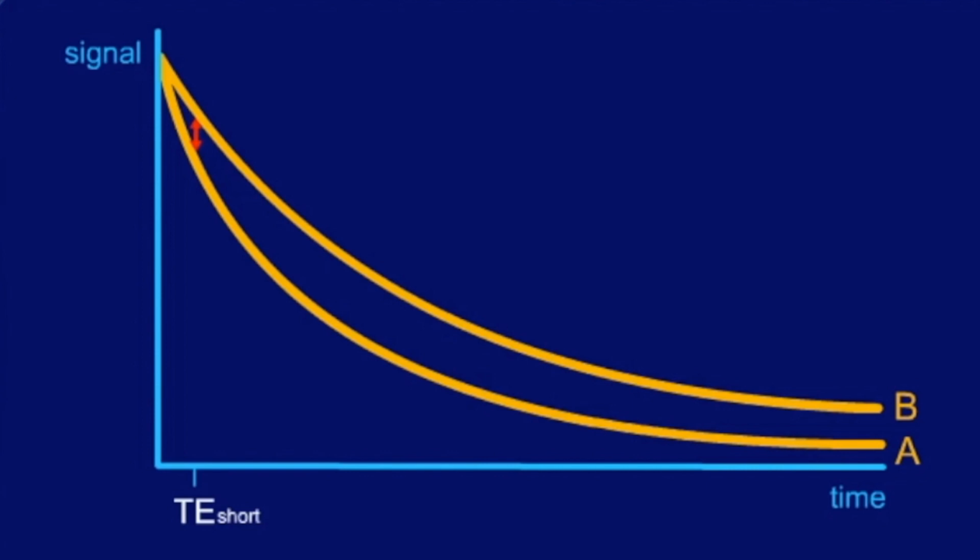As both T2 curves diverge, with a longer TE, the difference in T2 curves, and thus the difference in signal intensity, meaning contrast, is more pronounced in our example. So it might be reasonable to wait a very long TE. The resulting image should be very heavily T2 weighted.